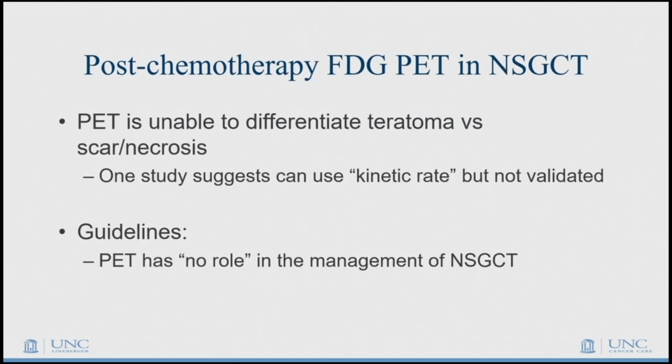PET is unable to differentiate teratoma versus scar necrosis. There's a couple studies looking at this theory of kinetic rate, but it's really not validated. And so really all guidelines say there's no role for PET in the management of non-seminoma germ cell tumor. I'll admit, as a PET-happy medical oncologist like most of us, we do it sometimes.